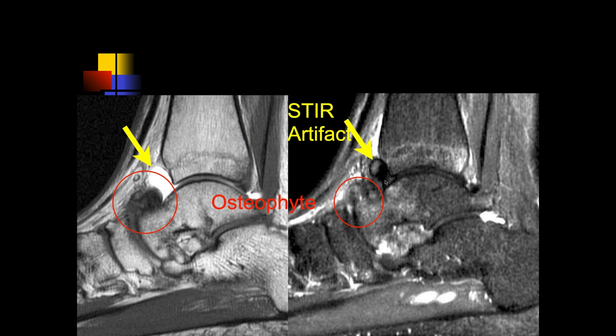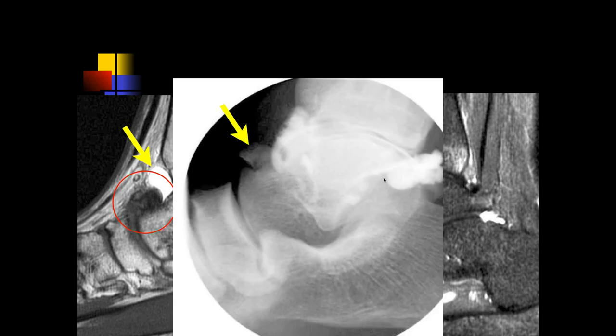STIR is a dangerous sequence when you put in contrast, because the signal suppression is based on the T1 time of the tissue, not whether it has fat in it — the T1 of contrast is often similar to that of fat, so the contrast will be suppressed. There's a lot of degenerative disease here — osteophytes at various joints. It almost looks like just a prominent osteophyte along the talus.